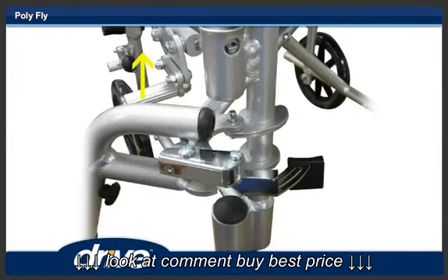Step 8. When the footrest is swung as far as it will go, lift the footrest up and off the Polyfly.